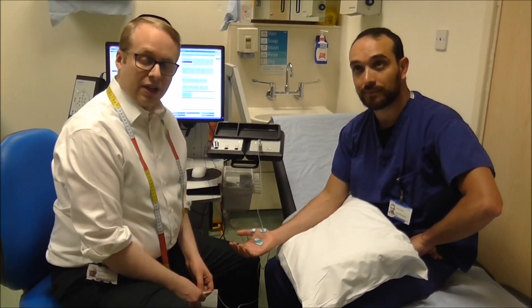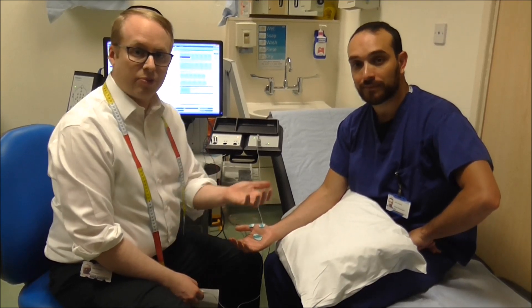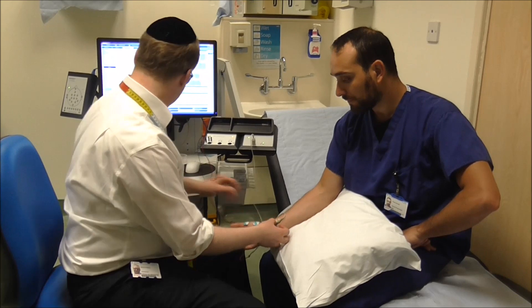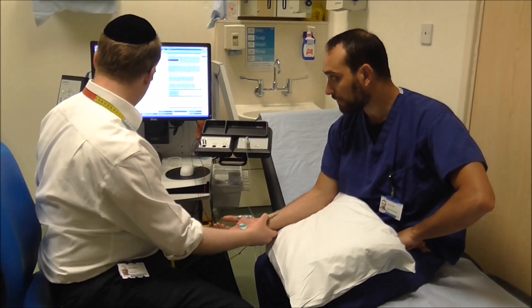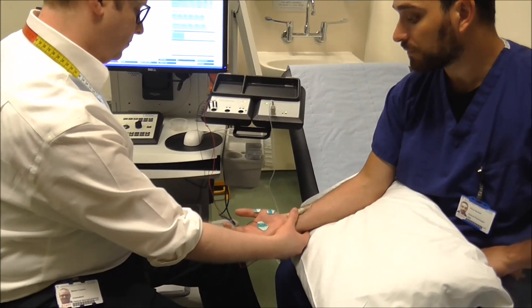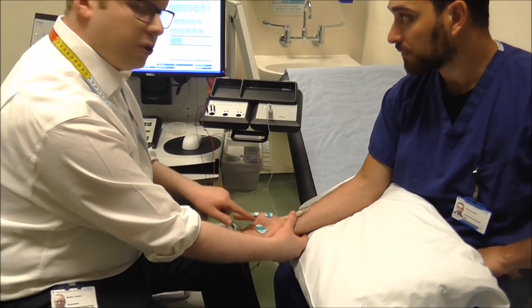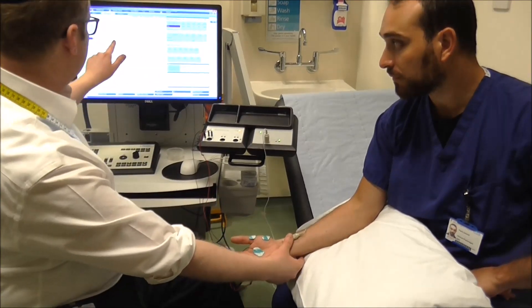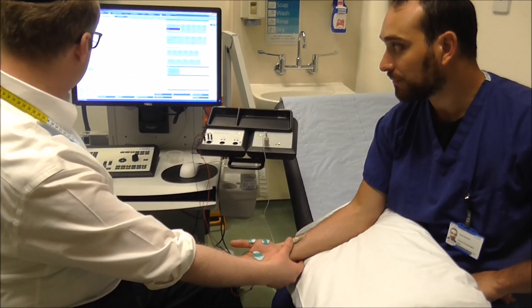I'm now going to demonstrate one of the motor nerves in the hand. This is one of the muscles that helps lift the thumb up. Electrical taps coming up — you can probably see the thumb twitching here. And this is the response that we're getting on the screen.